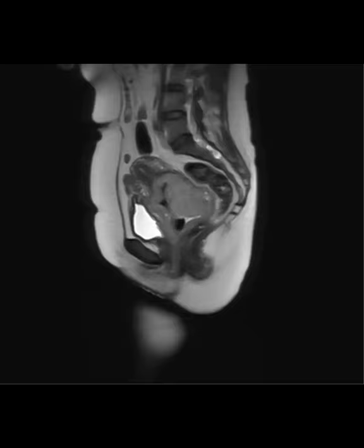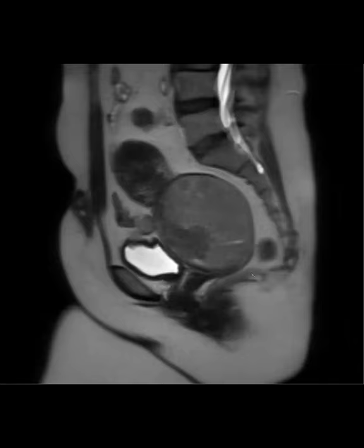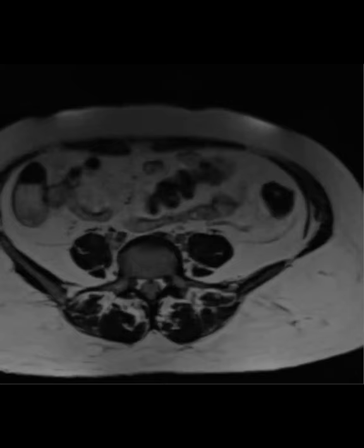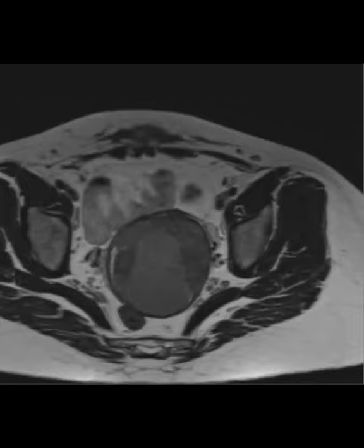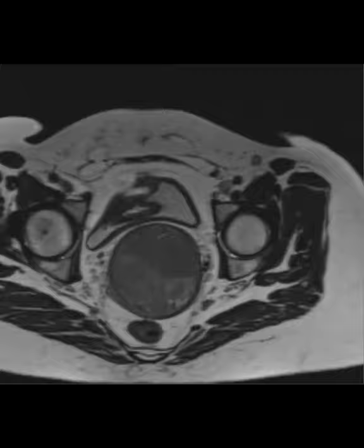This is my next case. You can see it's also a cervical mass. It's a little slow, but basically, it was pretty avidly enhancing. You can see it didn't look kind of as fungating as that last one. It didn't really look like a typical cervical cancer to us. This one also didn't appear to be extending beyond, at least most of it was not extending beyond the T2 dark cervical stroma. Any thoughts on what this could be?